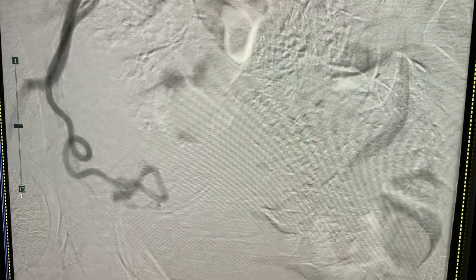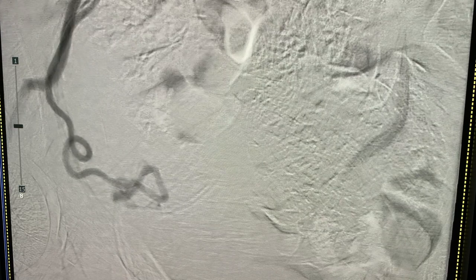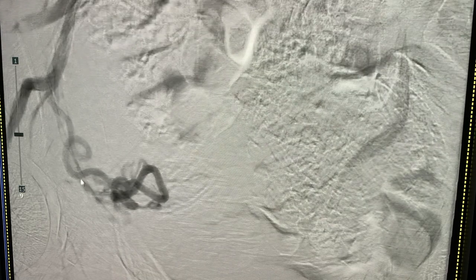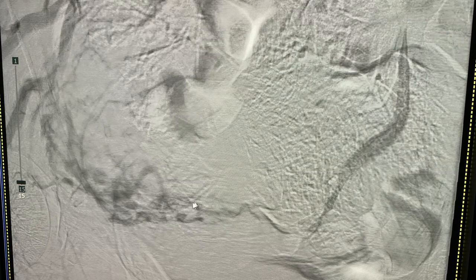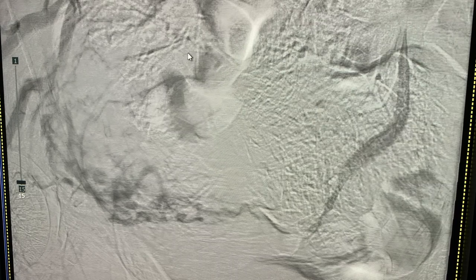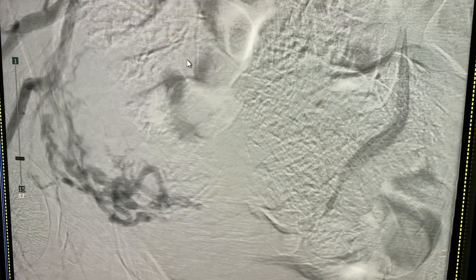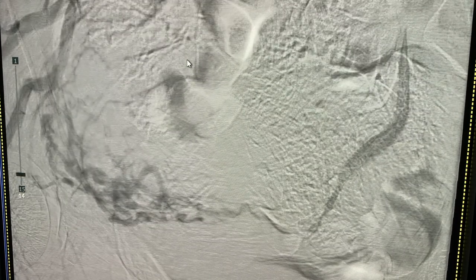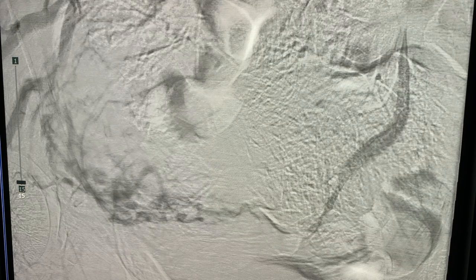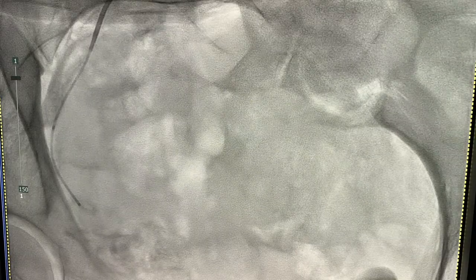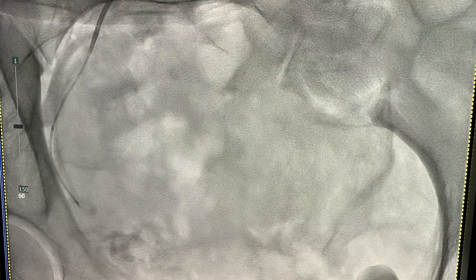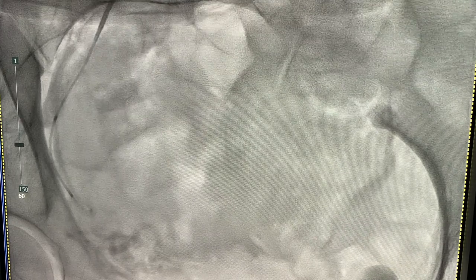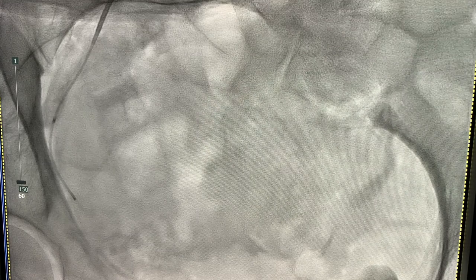We're now doing the same thing on the right side. Again, you see a very tortuous, hypertrophied right uterine artery supplying some fibroids. There is less fibroid blush this time because the majority of the supply in this particular woman came from the left side, which we embolized first. We're using particles again, getting good distal penetration with the 500 to 700 micron particles until we see stasis.